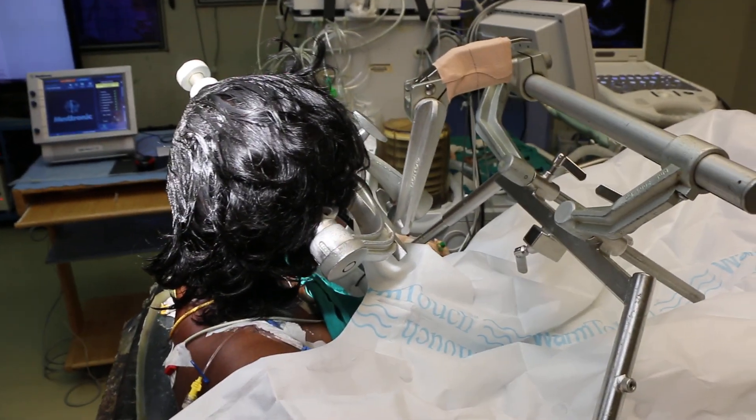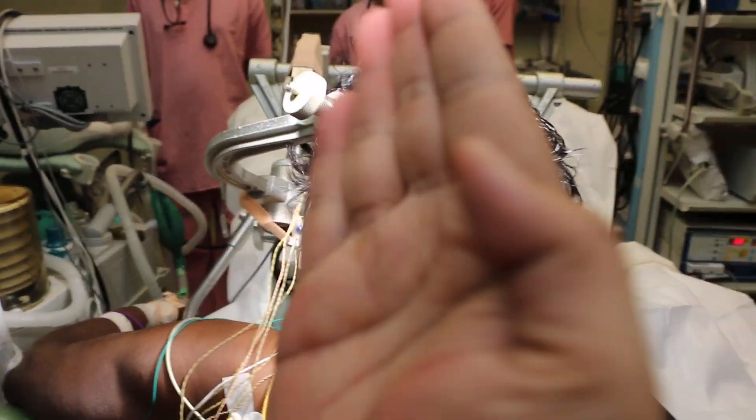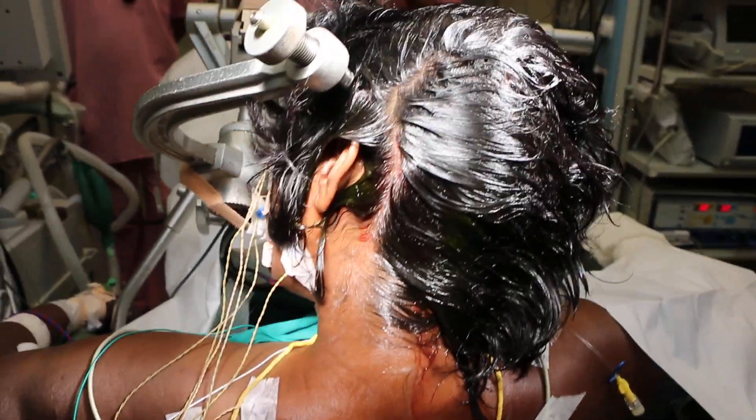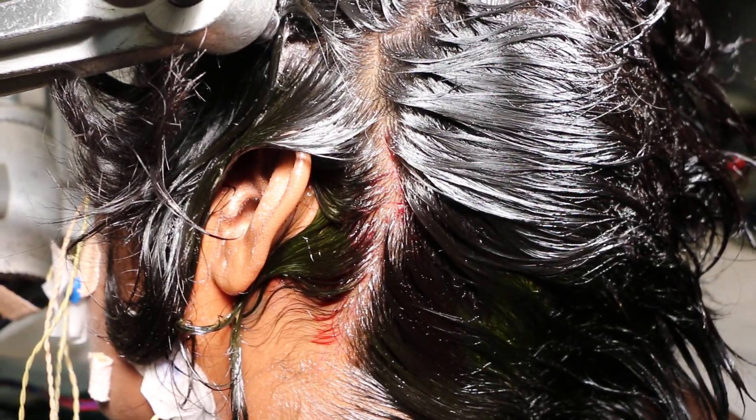Again, look at the position of the head — it is tilted towards the right side, tilted and rotated so that the chin is pointing towards this side, and the craniotomy site is marked here. The skin has been prepared and we are now proceeding with draping.